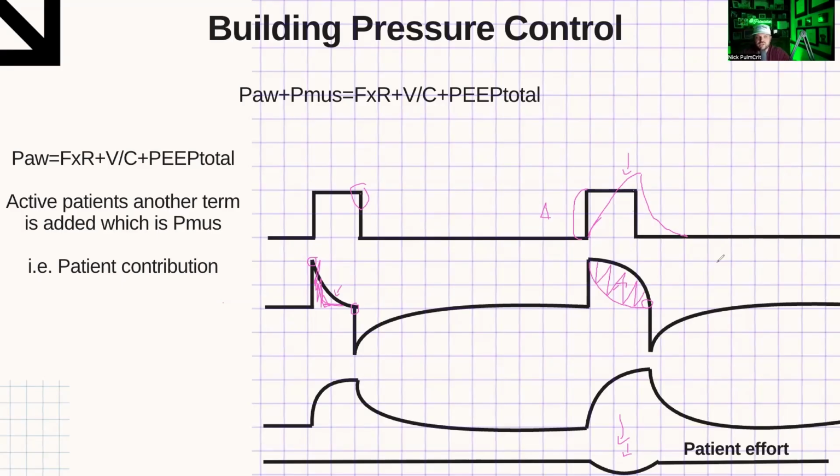And it could be lower if your I time is lower or your compliance is good or whatever. But if you have a curve that looks like this, which is probably the most important, if you take nothing else away, screenshot this curve in your mind: the flow curve is kicked out, and you can think that is synonymous with the patient pulling flow and volume more than their normal delta pressure and their mechanics would allow. And that plateau is something that you don't know what it is. So it could be high.